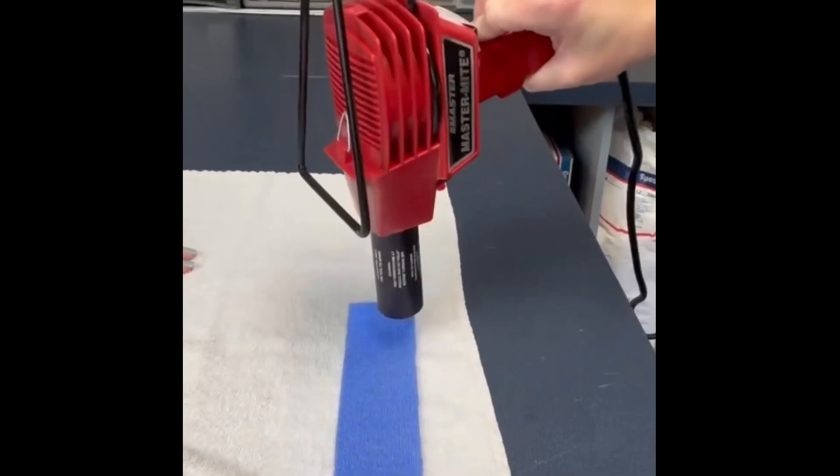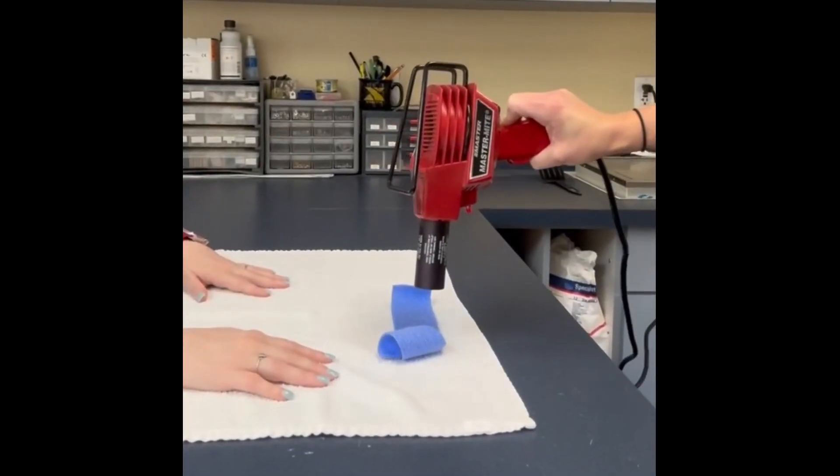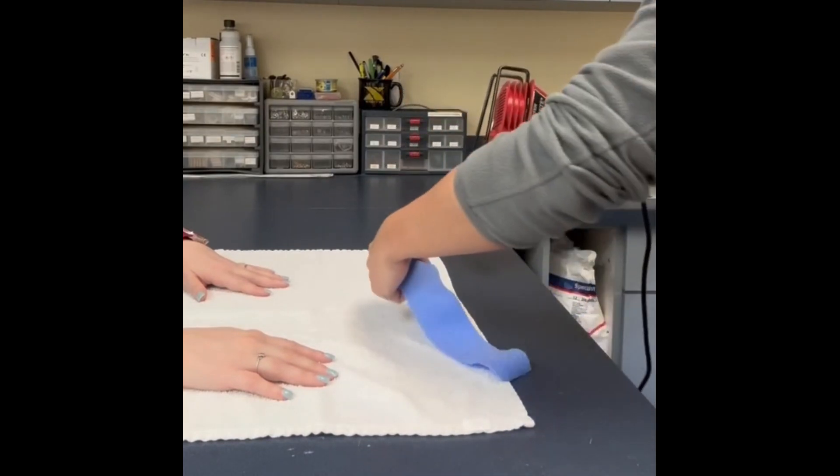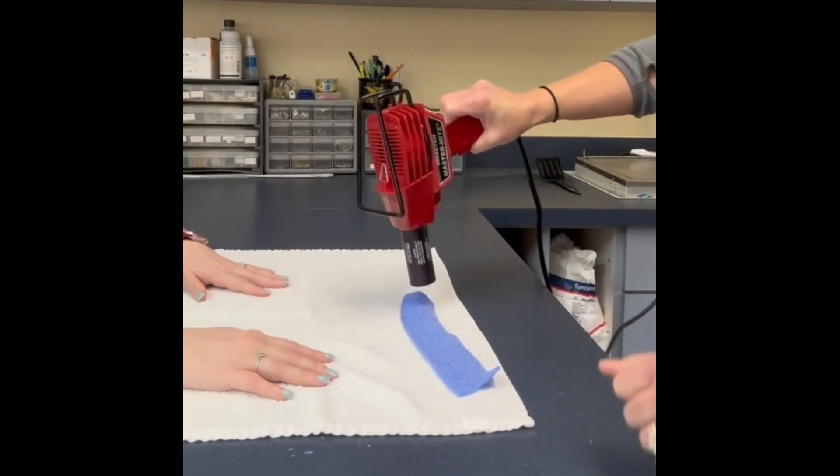Flip the Orphocast over once you see the edges beginning to curl on both sides. Repeat and flip over again as many times as you need. Make sure the Orphocast is not too warm before applying to the patient's skin.